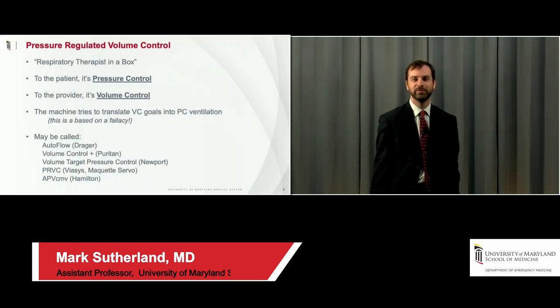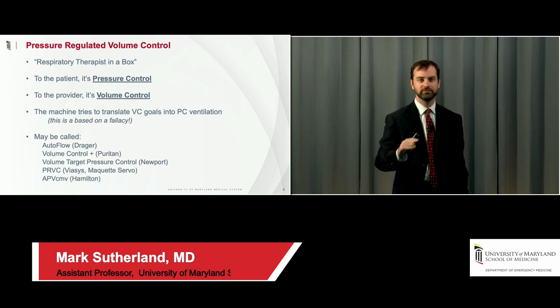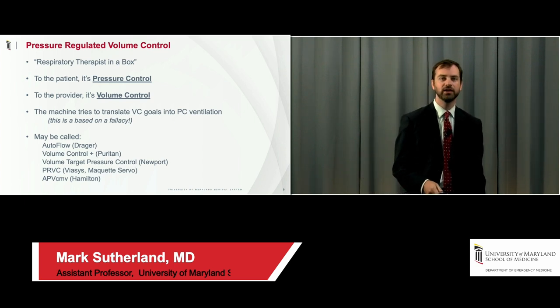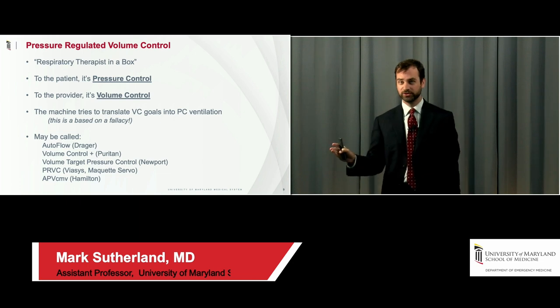Excellent. So let's talk a little about pressure-regulated volume control. PRVC was very popular in the late 2000s, I guess the teens, I don't know what the term for that is, around 2010. And I think it's cooled off, at least at our institution, a little bit. But it used to be, at least when I started my residency, you would see everybody was on PRVC.